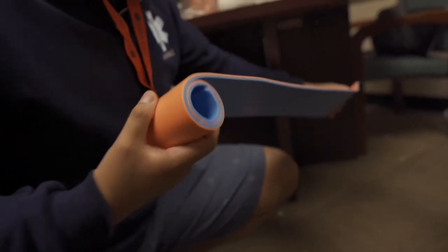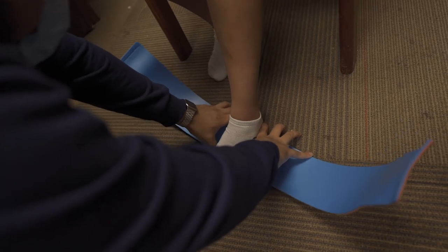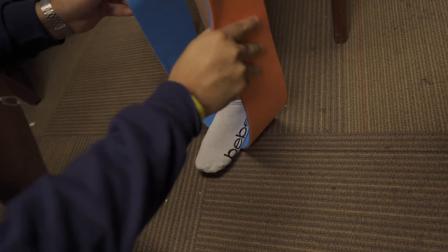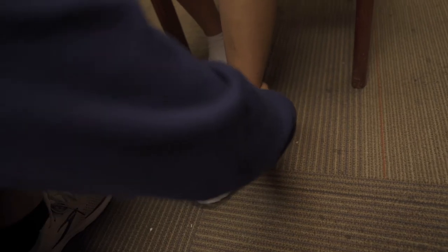With this first Sam splint, John is going to unravel it completely. He's going to place it directly under Vary's foot at the rear half — the posterior half of the foot. Right in the center of the Sam splint. Then do one side at a time, and then very tightly feed it up the ankle. Roll it all the way up the ankle.